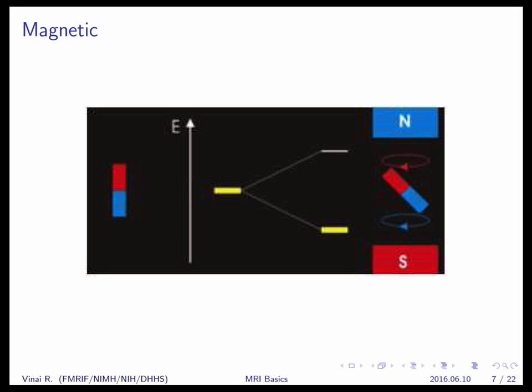In the orbital bands, you're talking about EPR. That's the same underlying physics as MR, but they look at energy in orbital bands, and that's a higher frequency technique. And over there, this bar magnet in the middle here, floating, is actually the alignment of the nucleus, the little magnet represented by the hydrogen atom's nucleus.